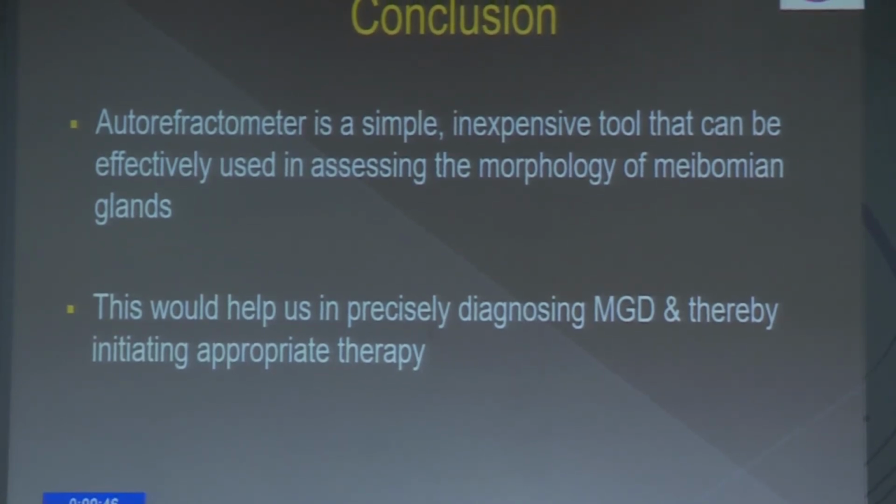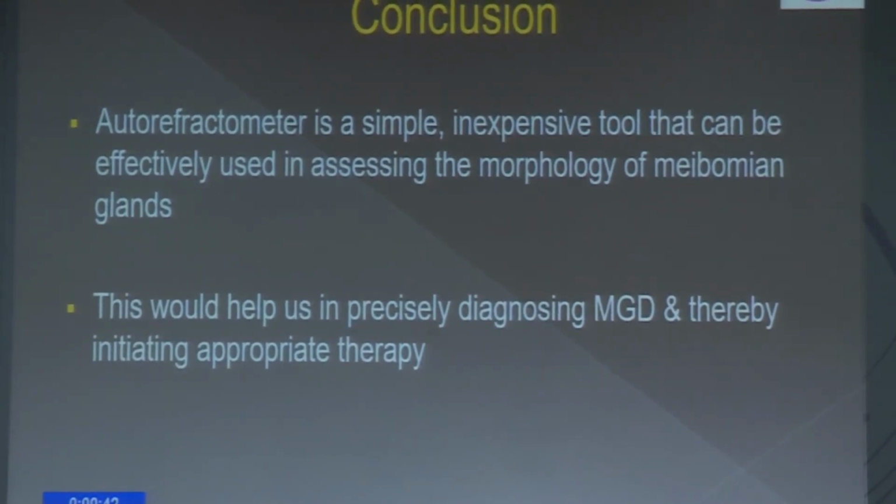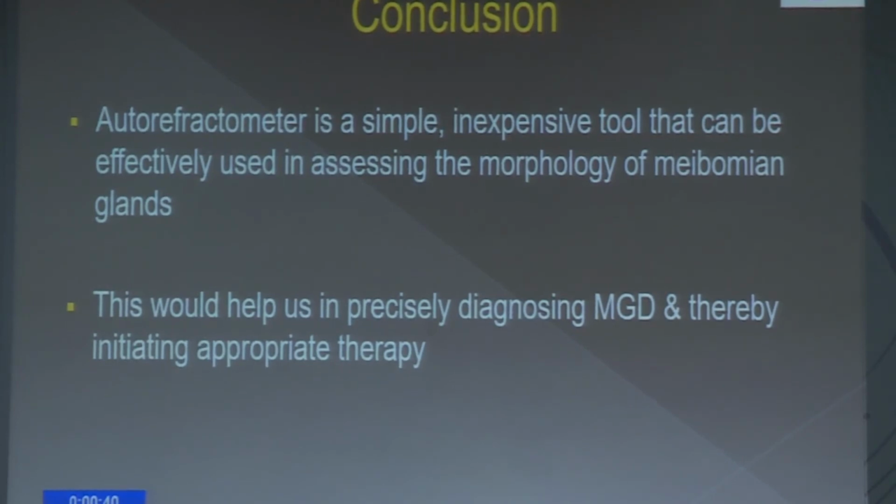So to conclude, the autorefractometer is a simple, inexpensive tool that can be effectively used in assessing the meibomian gland morphology in day-to-day practice. This would help us in precisely diagnosing the etiology, diagnosing the level of meibomian gland dysfunction, and thereby indicating appropriate therapy.